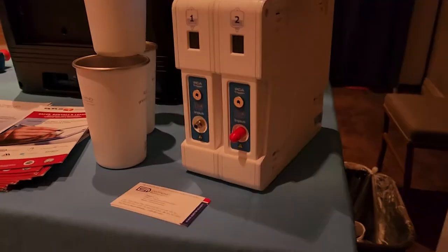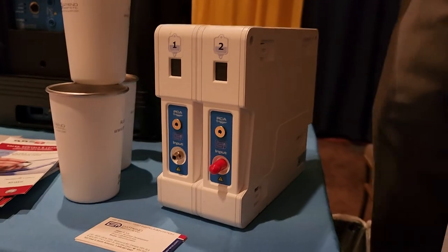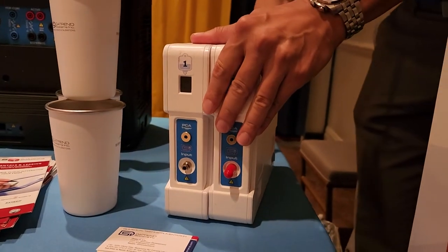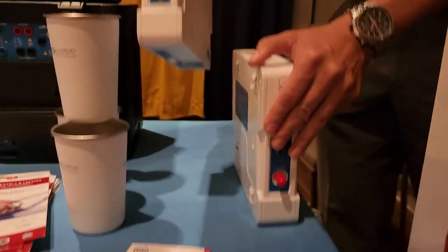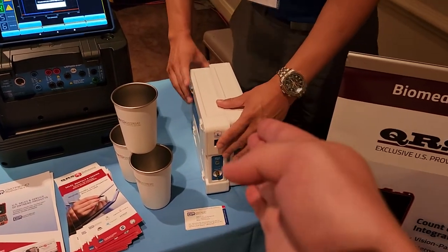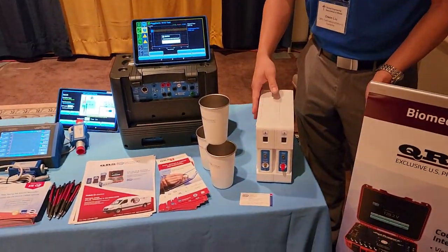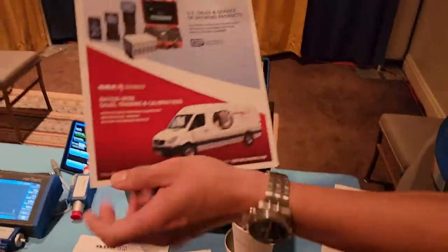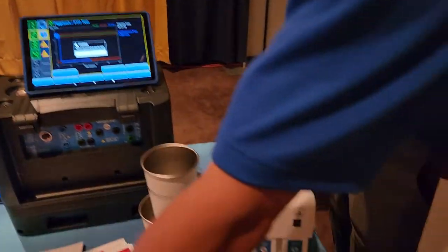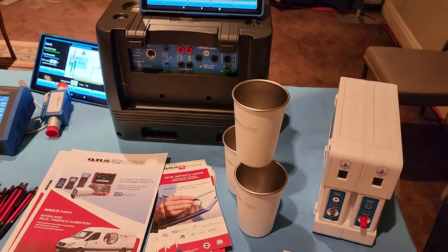We also have an infusion analyzer, and this is the latest release. You spoke about the modular setup — this device can be configured to up to six channels. That means if you need to get one calibrated, you can ship it out and you're not down. Holy cow, that's actually very cool. I can expand this up to six channels and do concurrent testing between all the channels. Anyway guys, I'm going to go because they're going to do an announcement.